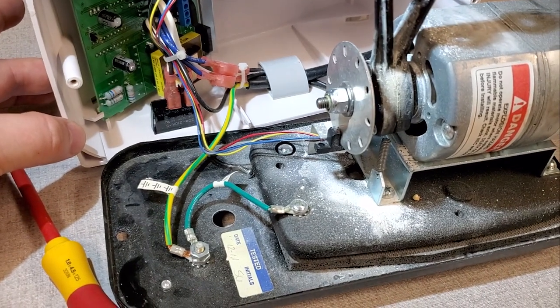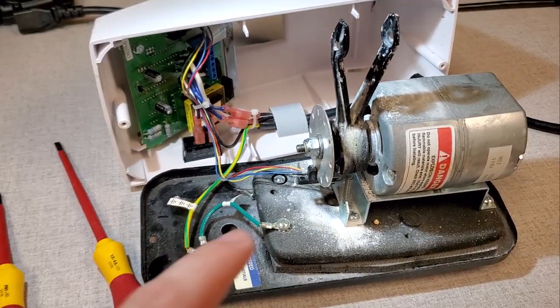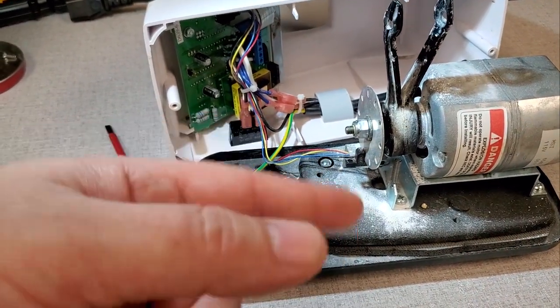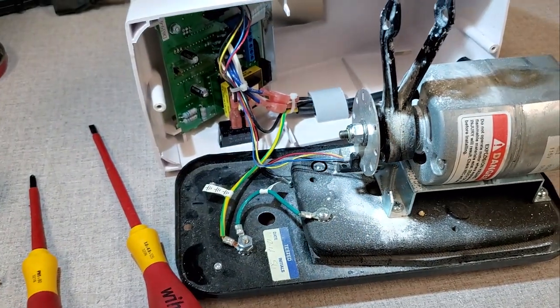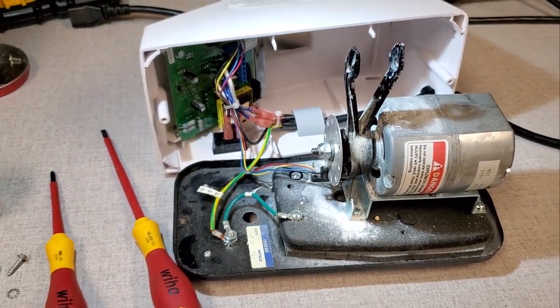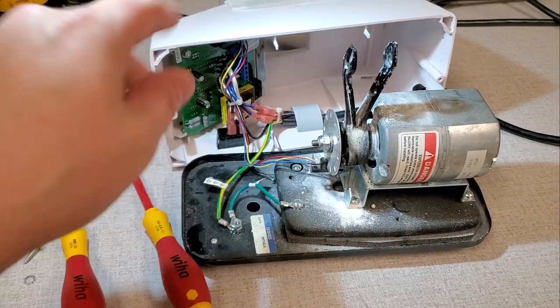You see how the disc spins for the set period of time, which I believe is 3 or 4 seconds. It knows that the motor starts spinning, starts the timer, and the timer stops, shuts off electricity, and that's it. So that's the last motor, guys. That's a universal motor and how it's controlled via DC electronics.